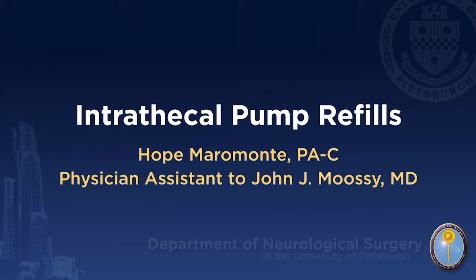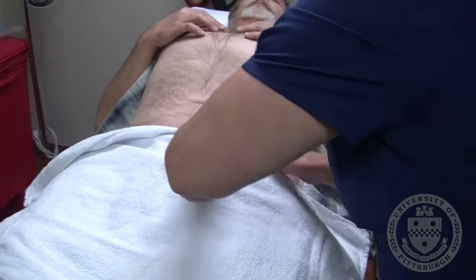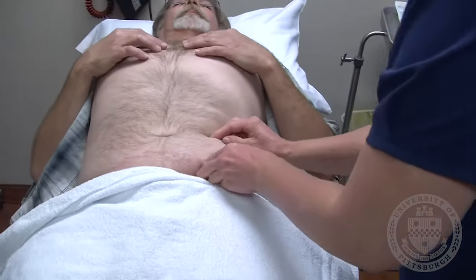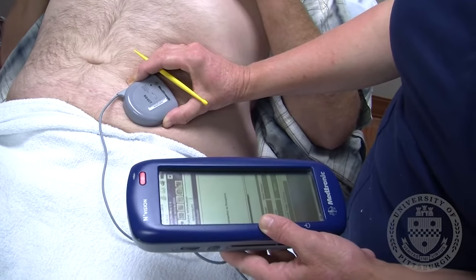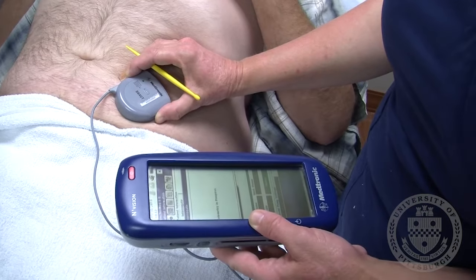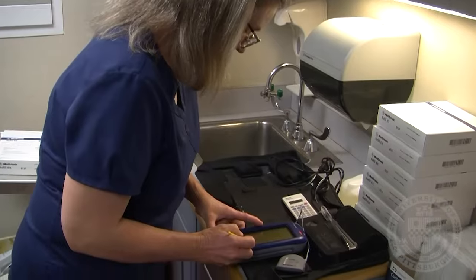Intrathecal pump refills are fairly quick and cause very little discomfort. You will lay on the exam chair with the pump site exposed. The provider will palpate around the pump to determine its orientation. The pump is interrogated to confirm the current type of medication, concentration, and amount of medicine remaining in the pump.